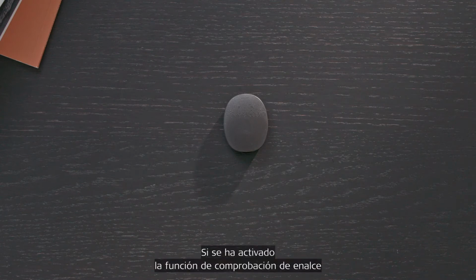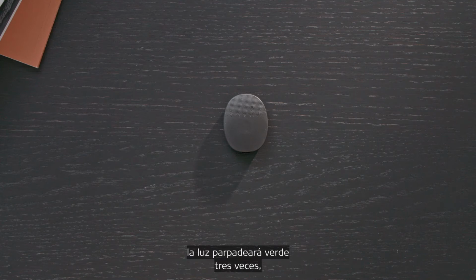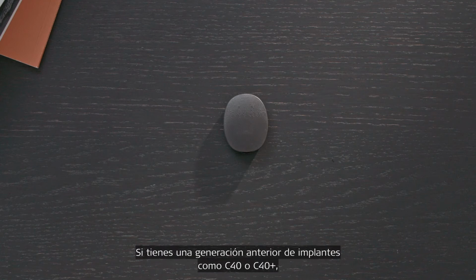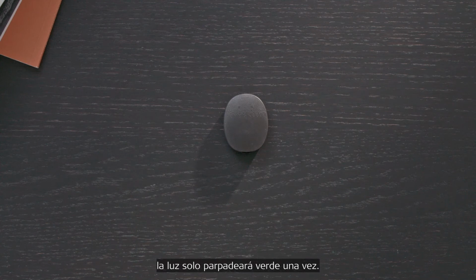If the link monitoring function is activated, the light will blink green 3 times when Rondo 3 is placed over the implant. This shows that Rondo 3 is working correctly and is communicating with your implant. If you have an older generation implant like C40 or C40 Plus, the light will only blink green once.